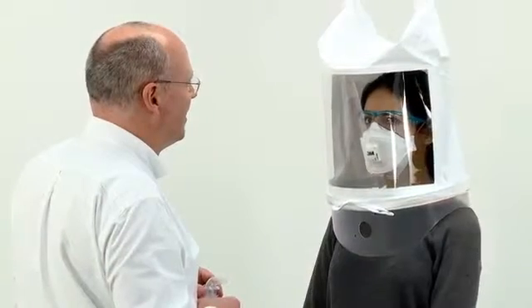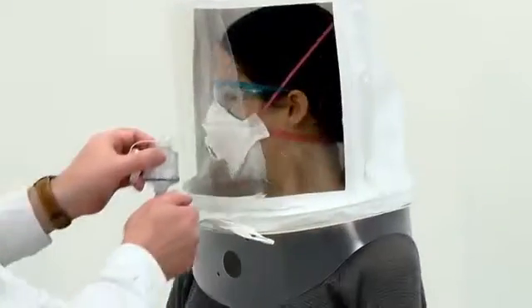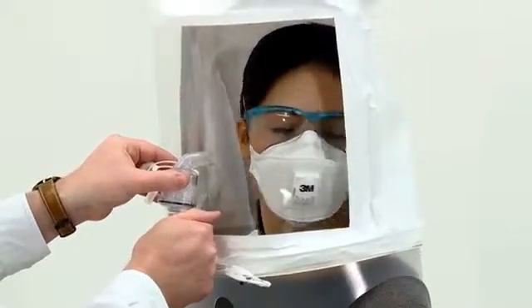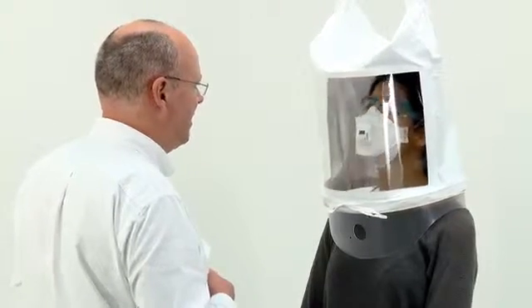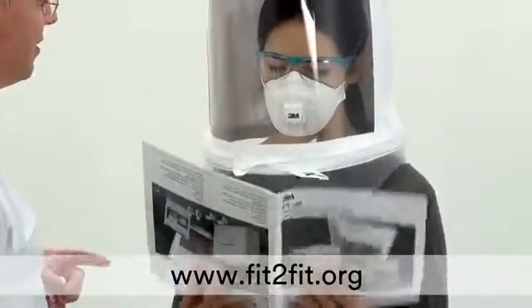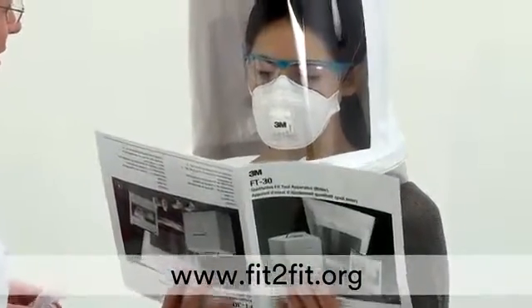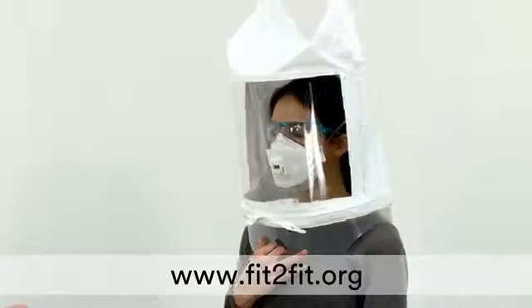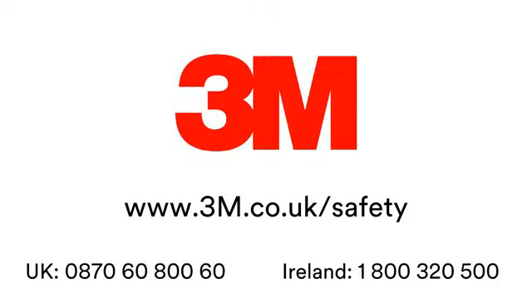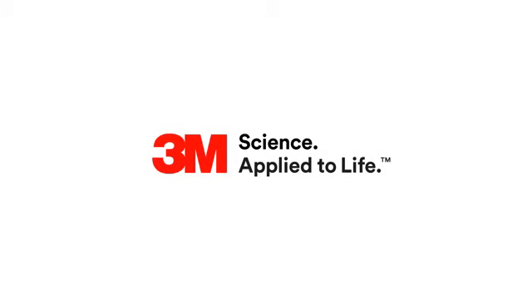Fit testing is an important step towards ensuring that the correct levels of protection are achieved from a respirator. It is vital that a fit tester fully understands the test procedure and carefully briefs and monitors the test subject. For further details regarding the competence expected of a fit tester, see the HSE guidance document, and for information on the accreditation scheme for fit testers, visit www.fittofit.org. For further information please visit www.3m.co.uk/safety or call our UK and Ireland helpline numbers.